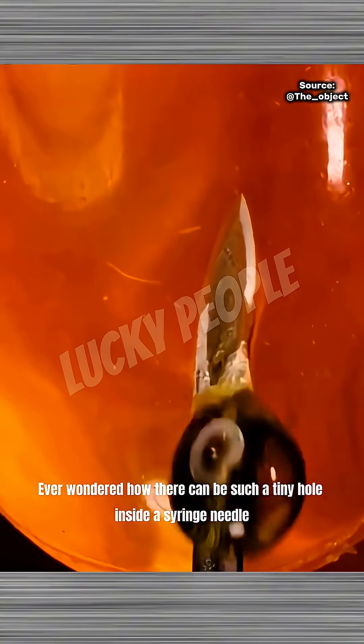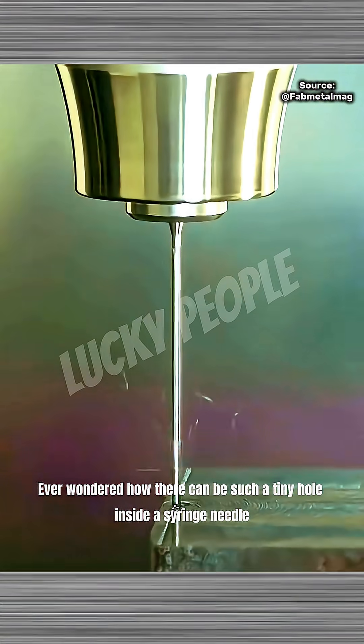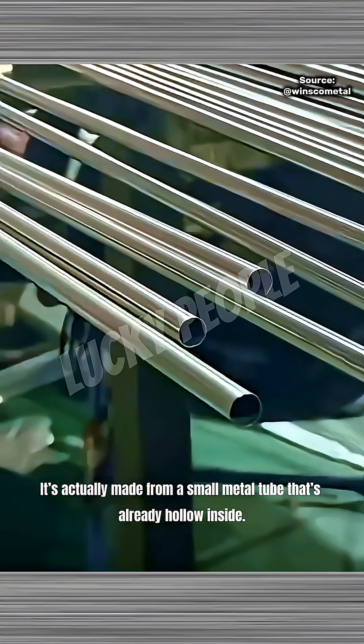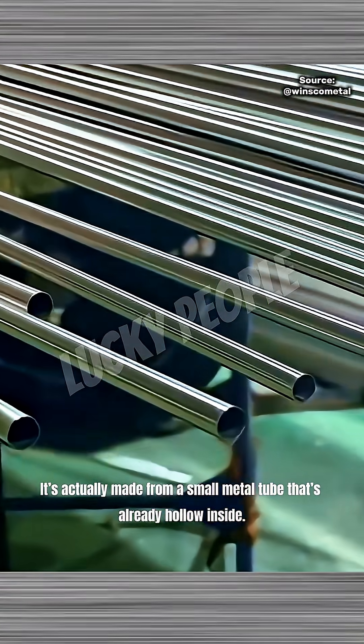Ever wondered how there can be such a tiny hole inside a syringe needle? Well, one thing's for sure — that needle isn't drilled. It's actually made from a small metal tube that's already hollow inside.